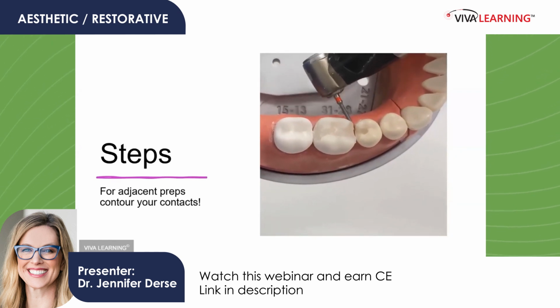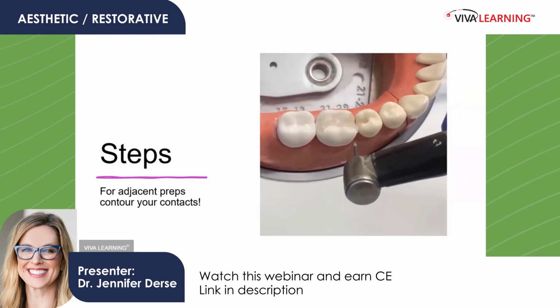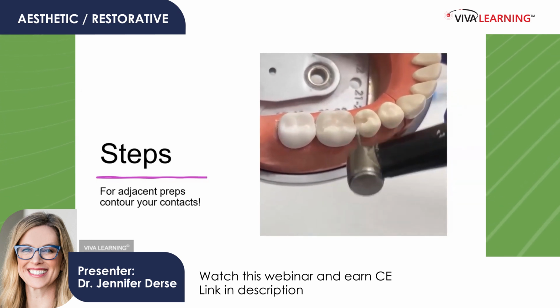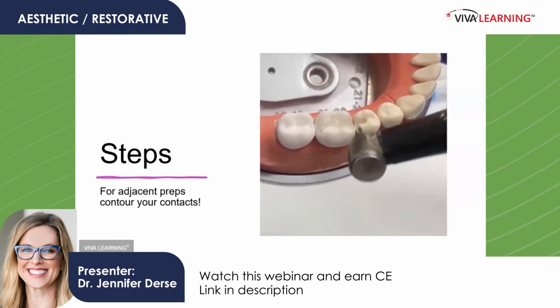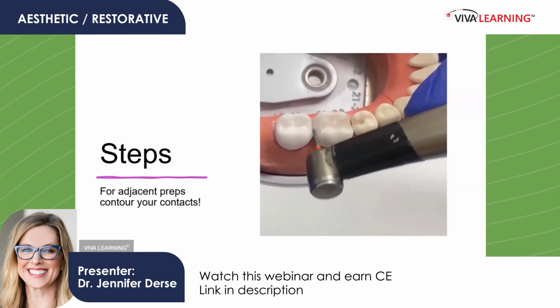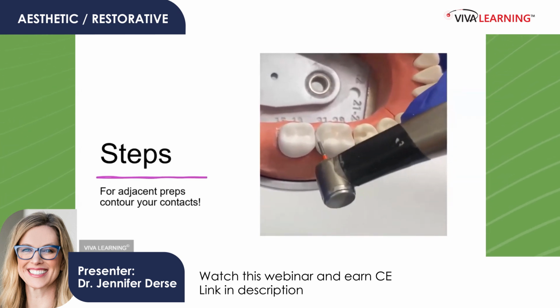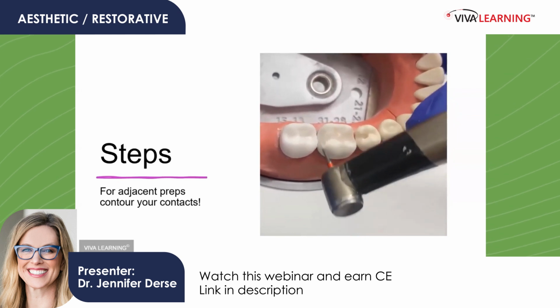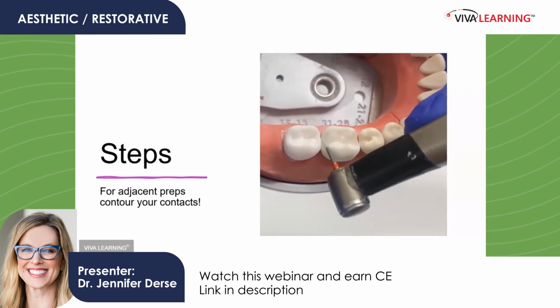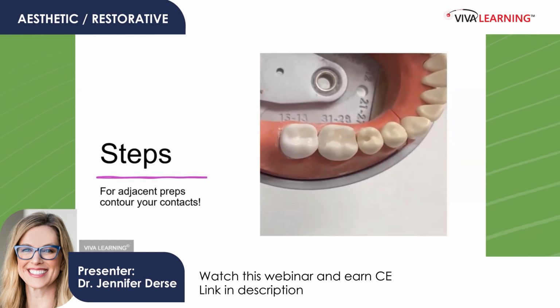So getting your red stripe fine diamond to go in and clean out and buff that perpendicular to your box, because if you use a carbide burr, the carbide burr ditches out a lot more. It's really hard to ditch out these fine diamonds, and you get to use them again. We buy these all from Meisinger, and just buff against it to give your filling some shape.